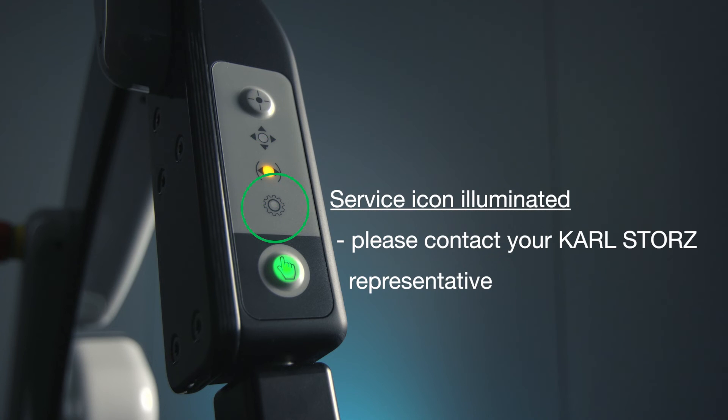This is the service icon. When illuminated, it means an internal error has been detected. Please contact your Karl Stortz representative.